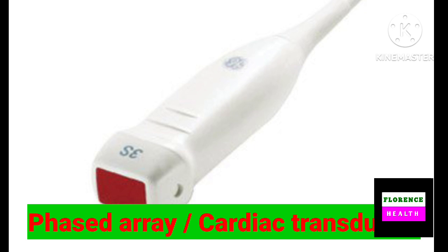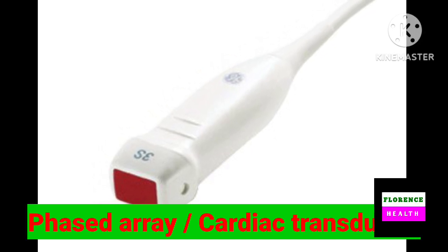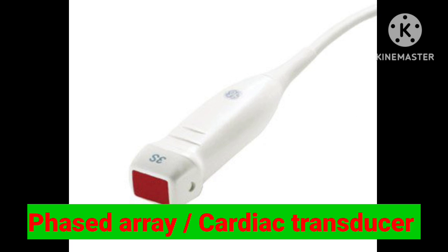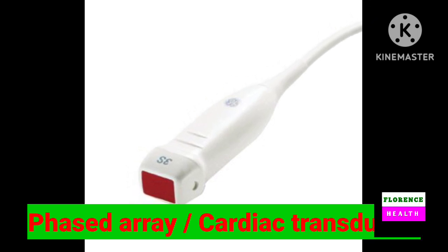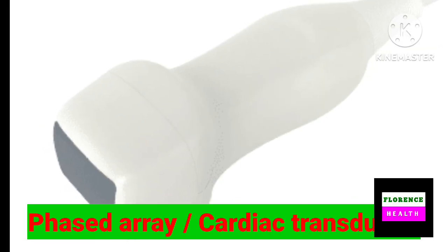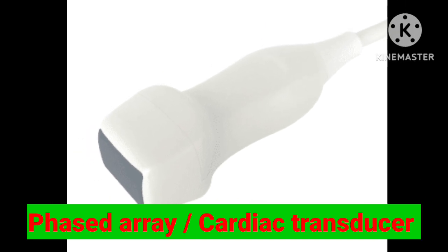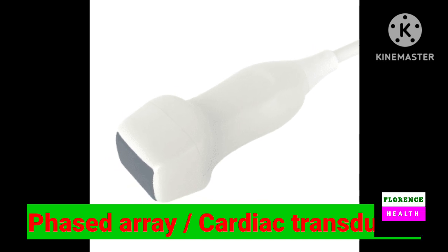The slide showing cardiac transducer or phase array transducer. It has small footprints. It is used for cardiac imaging or echocardiography and transcranial ultrasound for neonate. Again, the figure showing cardiac transducer or phase array transducer, used for cardiac imaging and transcranial ultrasound of neonate.